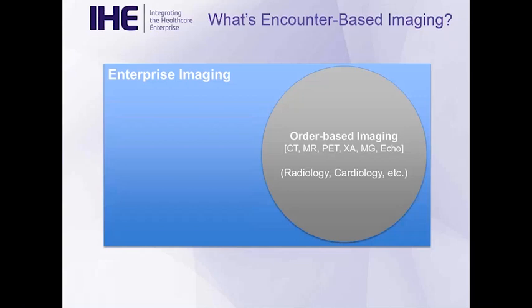Typically, there is an order placed by a referring physician. The scan is scheduled in advance. It's performed off work lists. There is a formal interpretation and reading process by a radiologist at the end that results in a report which closes out the order. And that workflow has been pretty well integrated and pretty well automated over the years. In fact, the very first profile that IHE did was a scheduled workflow to address that space.